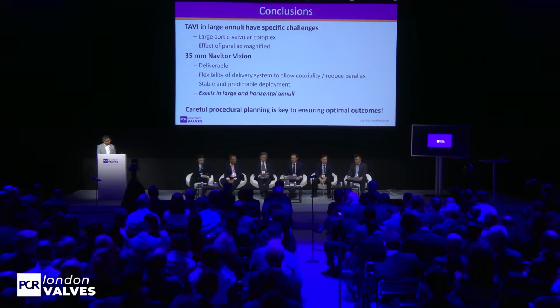Thank you so much. Excellent demonstration and excellent outcome. I have a really easy question. How relevant is it in your practice to have a large self-expandable platform like Navitor 35, which is so easy to implant? How many percent of patients do you expect to treat in Australia, for example, with this device? Yeah, so the large annuli in our population account for somewhere between 15 and 20% of the patients we see.